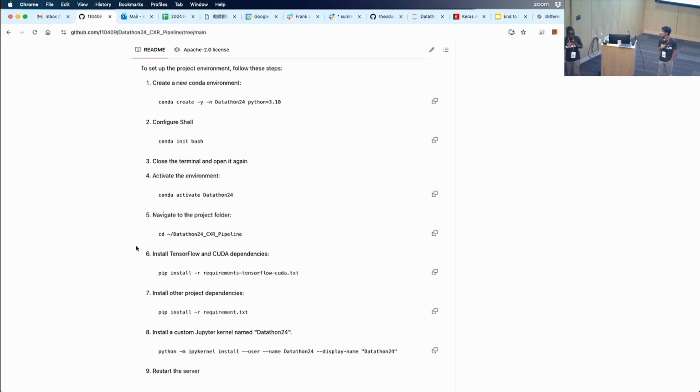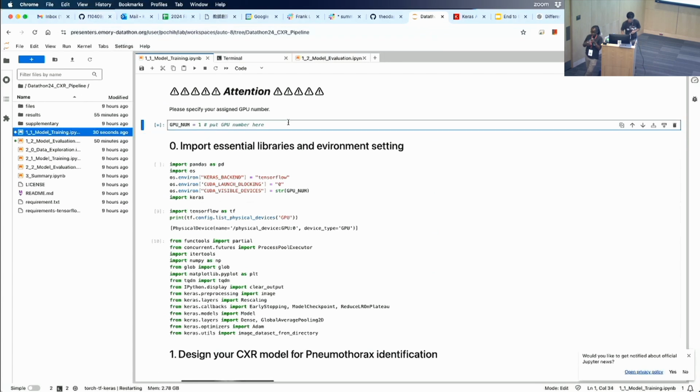So this is a real-world machine learning problem, right? Your environment is where you'll build things, and there are best practices for building them. The way to do it is with something like a Conda environment, so you can look up how to follow best practices and share environments.